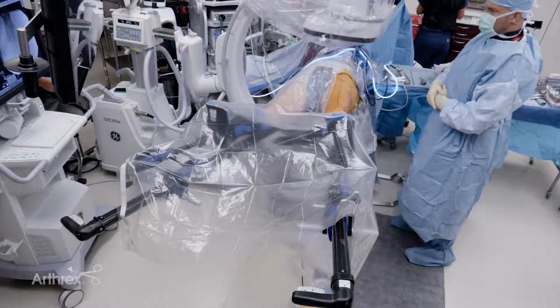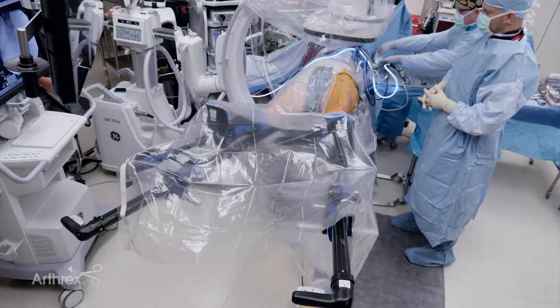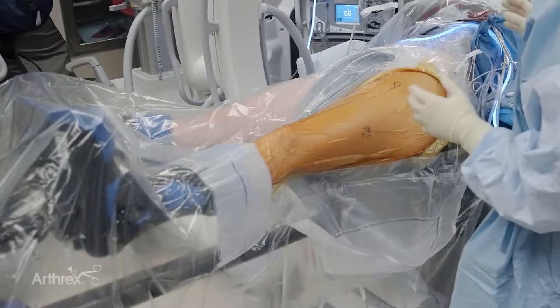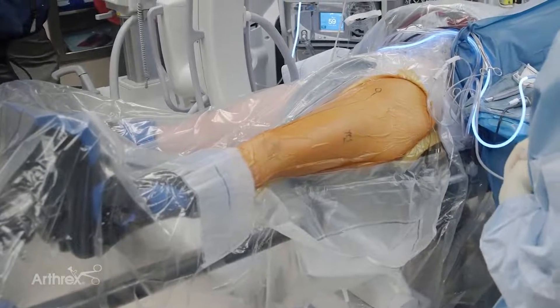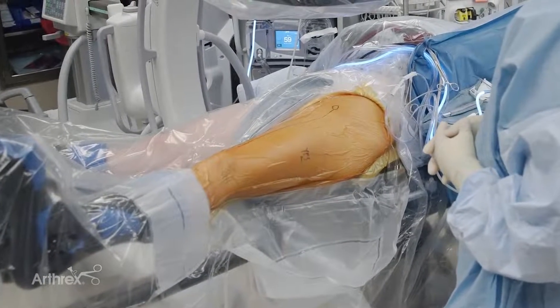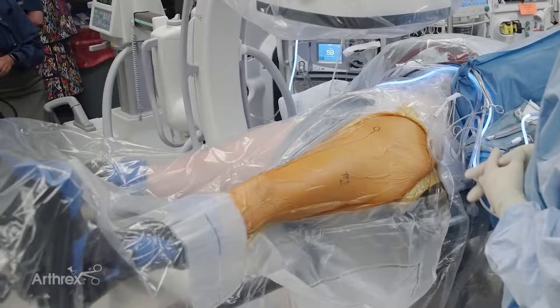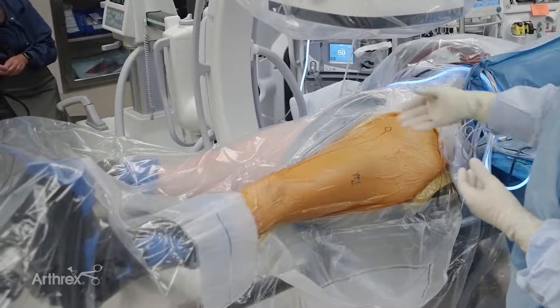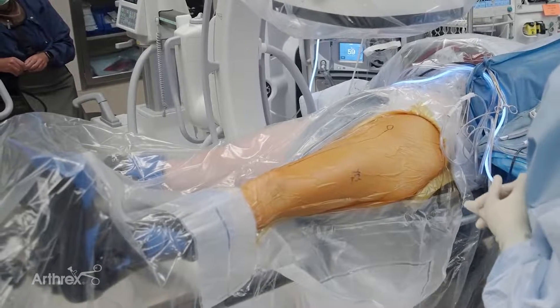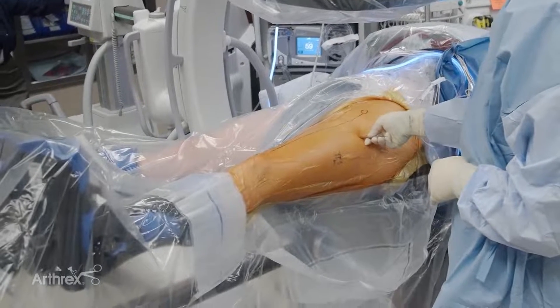We've applied traction and then prepped and draped. Traction is still applied. We have a nice working space here — there's no compression of the soft tissues from the post, and there's no paralytic on board. Our anesthesia team can really manage pain levels, leading to a more efficient anesthetic. There are no reversal agents needed because we don't have any paralytics on board. Overall, we think of a better patient experience: less pain from no post between the legs, no risk for perineal palsy, and no risk for pudendal nerve palsy from compression in the perineum.